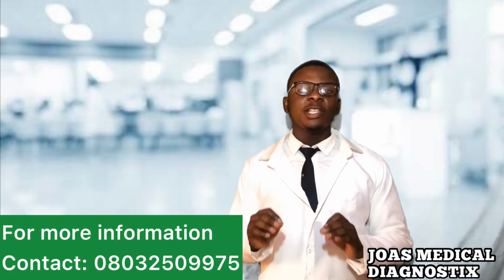Hysterosalpingography is one of these common compound words that we use in medicine. Hystero comes from the Greek word for uterus and salpingo comes from the Greek word for tube. So we are looking at the uterus and the tube.